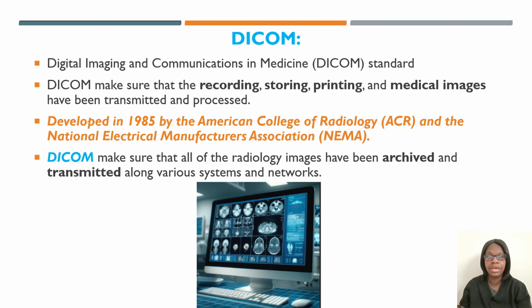Now we have DICOM. DICOM stands for Digital Imaging and Communications in Medicine Standard. So just make sure you know the acronym for DICOM, but make sure you know what it is. DICOM makes sure that the recording, storing, printing, and transmitting of medical images are processed without any hiccups, any problems.